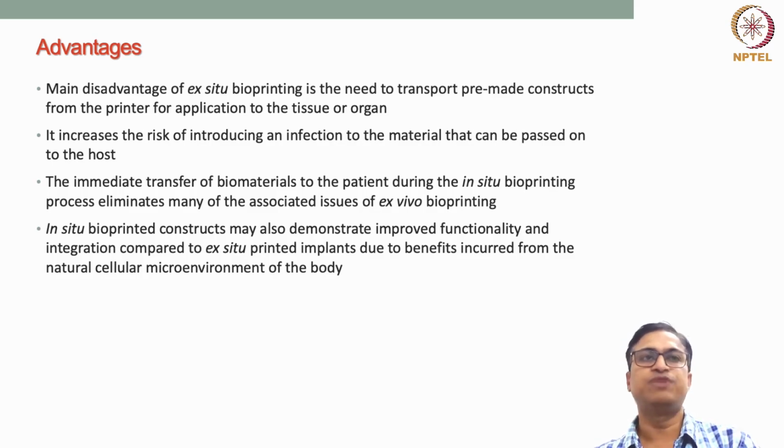So we need to be very cautious about this thing. But when we actually deal with in situ bioprinting, because this process transfers the biomaterial to the patient wound bed directly, that's why this process eliminates many of these associated issues of ex vivo bioprinting, like the fabrication is directly on the wound bed.